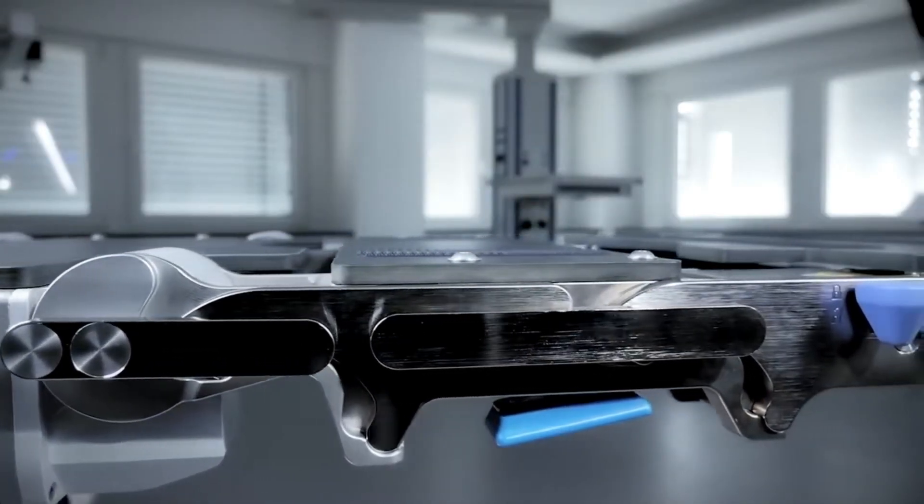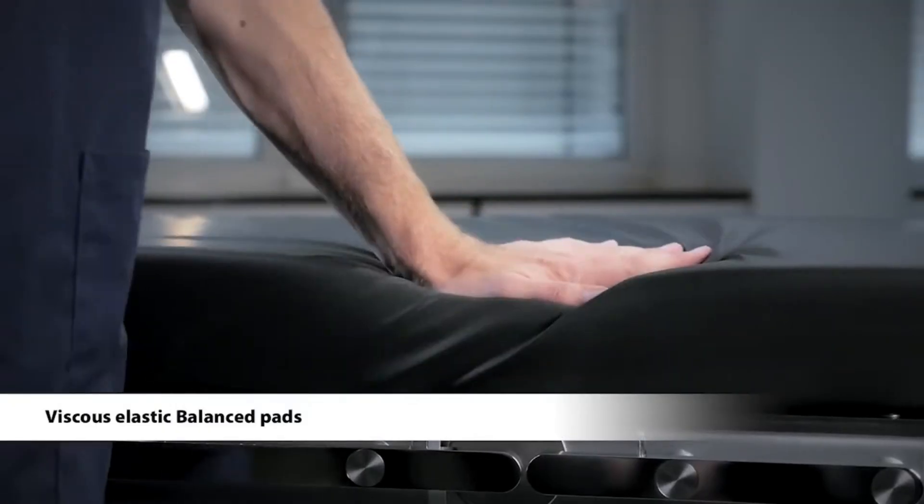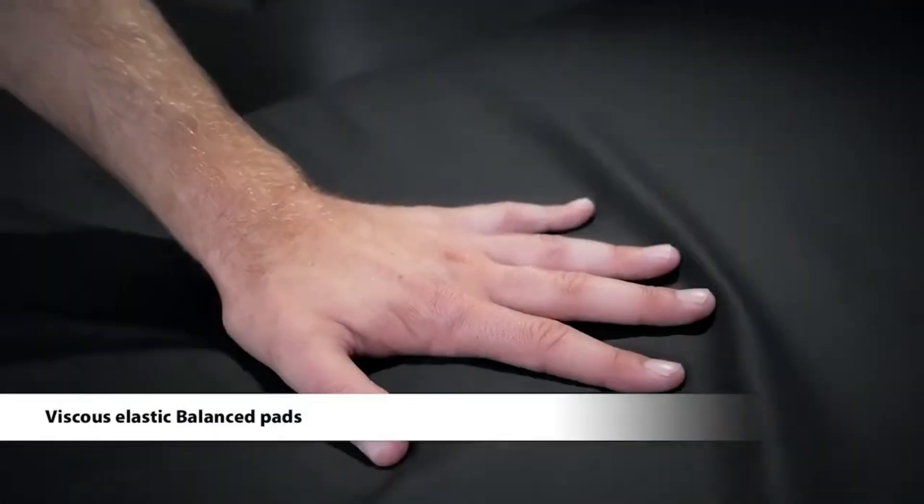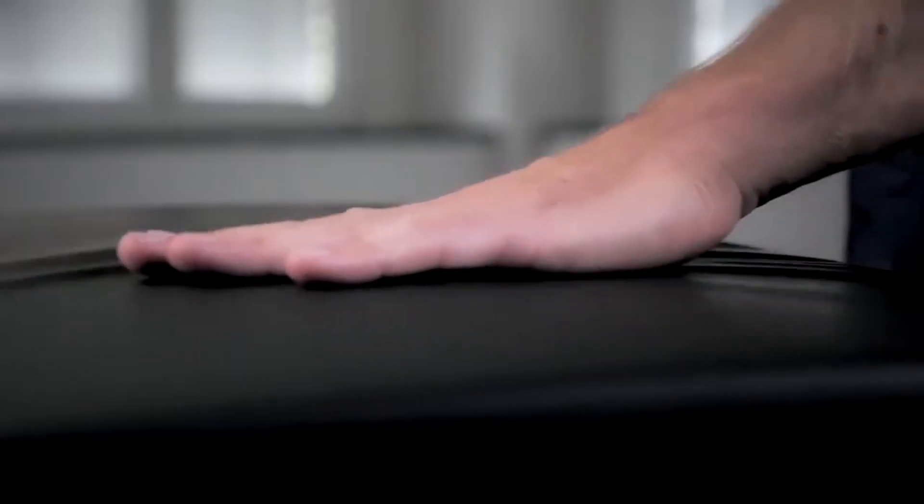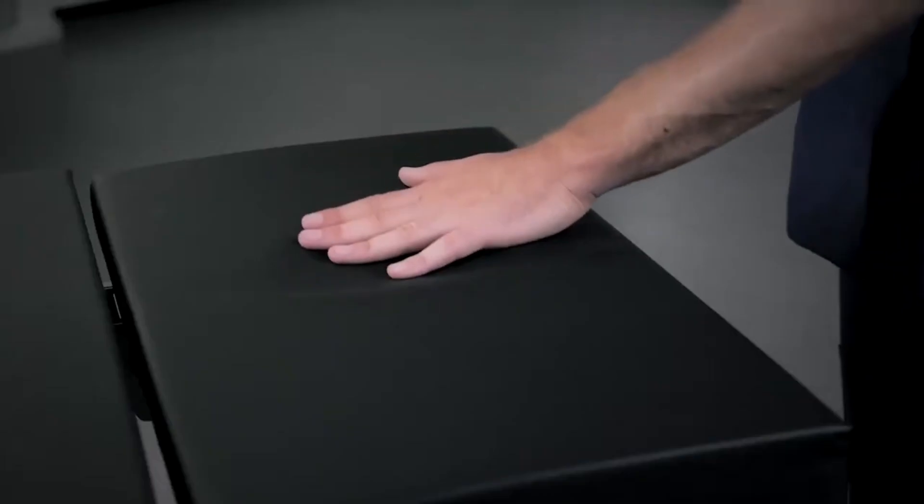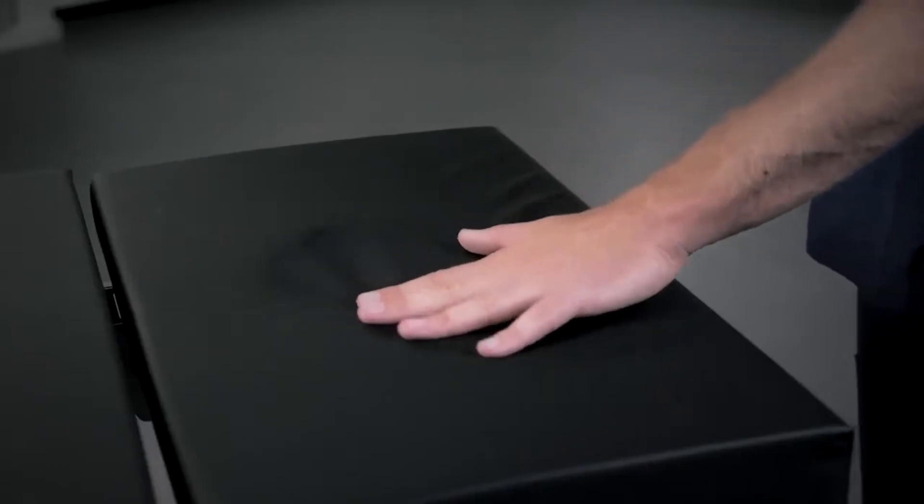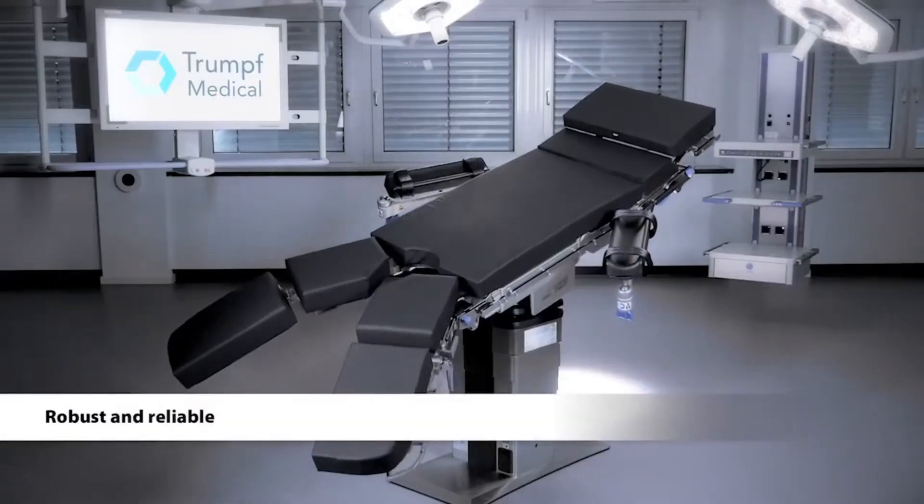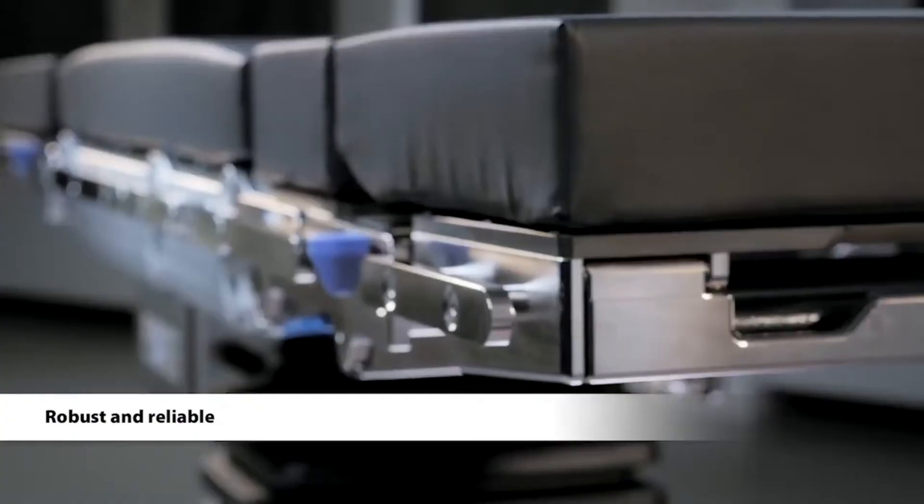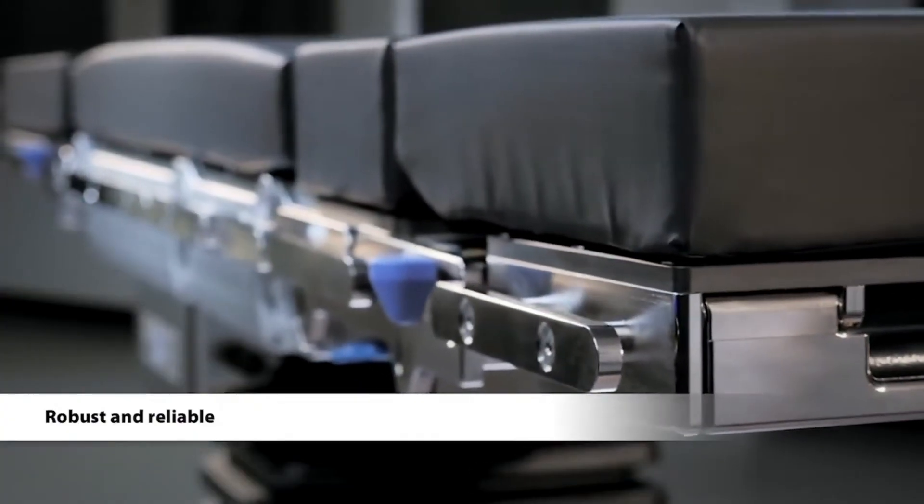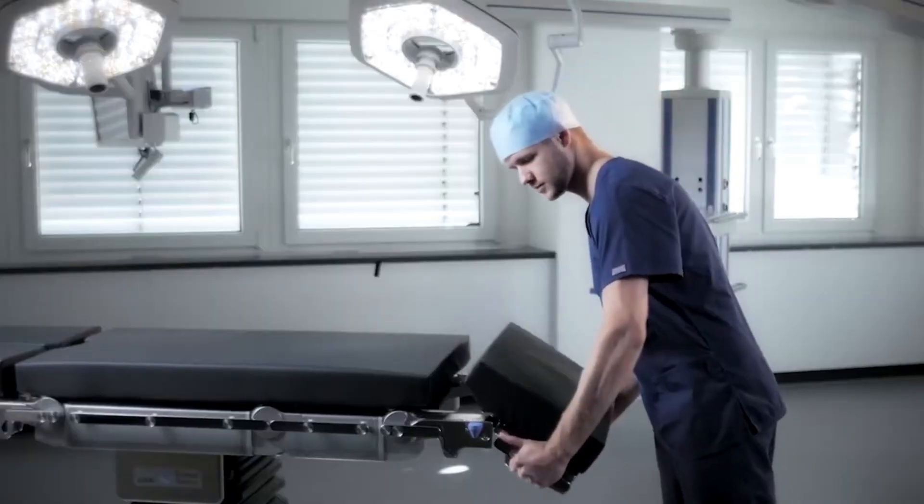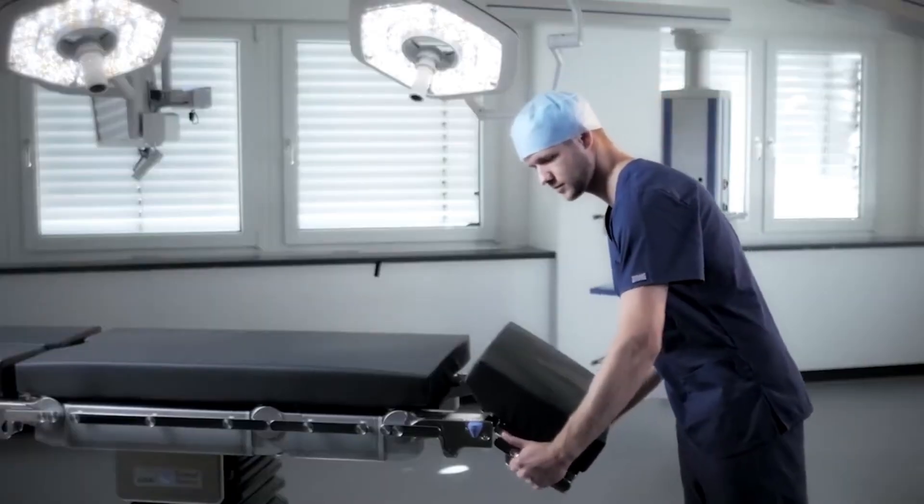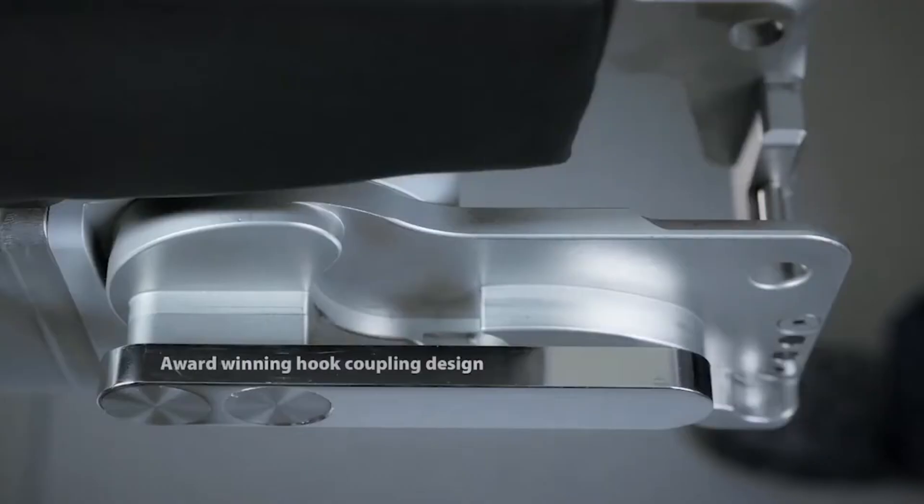Elevation and tilting mechanisms—electric or hydraulic—raise or lower the table and tilt it in various directions to position the patient. Sectional adjustments allow the ability to adjust individual sections of the tabletop for specific surgical positions. A hand or foot-operated system allows the surgical team to adjust the table's position.